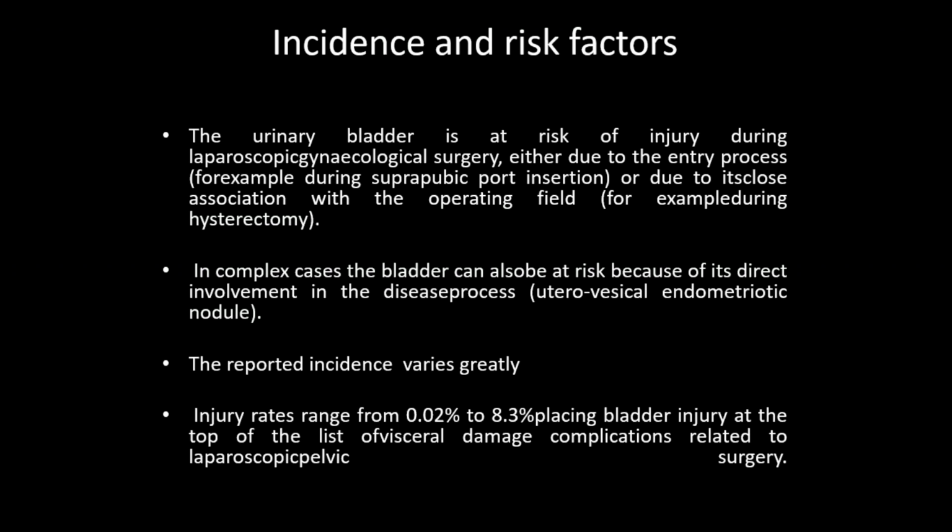The urinary bladder is at risk of injury during laparoscopic procedures. The bladder is the most common viscus to be injured, particularly during total laparoscopic hysterectomy, during dissection of the bladder from the anterior lower corporeal and cervical portion.